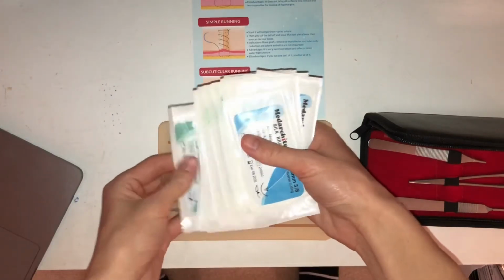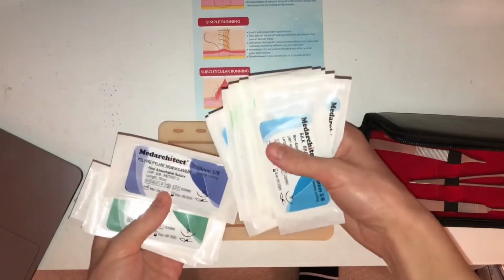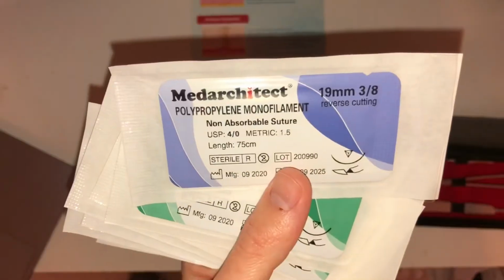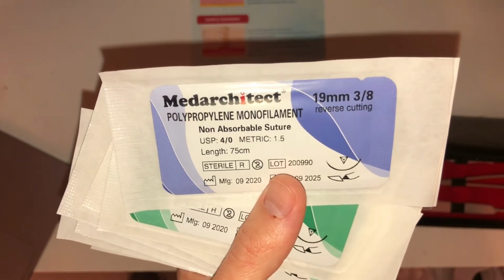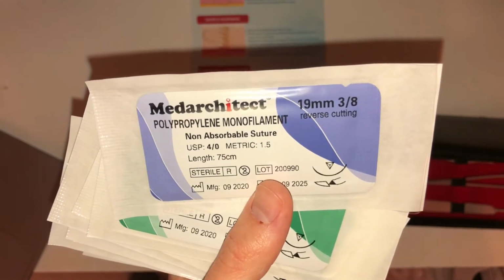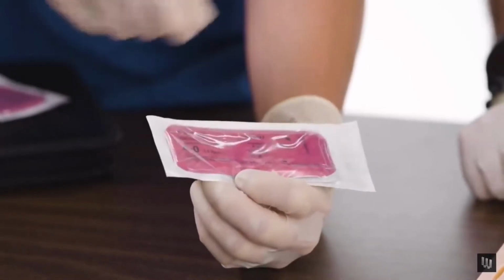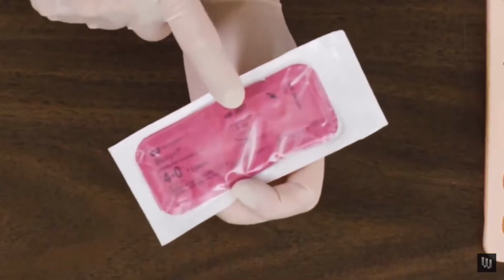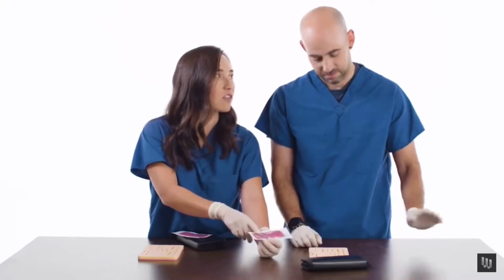All right, we know it's 4-0. Doesn't look like polyester braided. Would you say monofilament? That's a 3-0. Polypropylene monofilament, 4-0, length 75 centimeters, metric is 1.5. Yeah, and this one is non-absorbable. So let's put that off to the side. I think that's the one we're using. Cutting needle is what we use to close skin with. This is an absorbable monofilament. Okay, 4-0, so that's a little smaller than you've been working with.